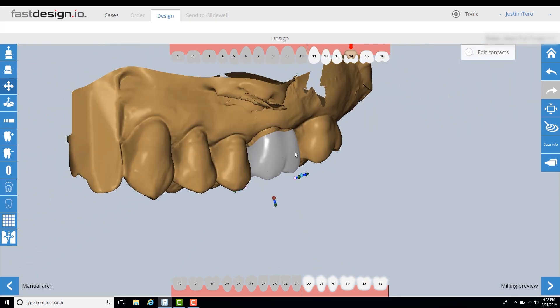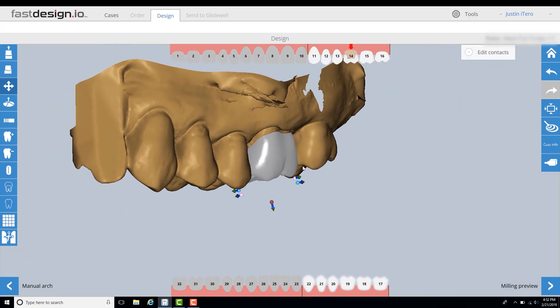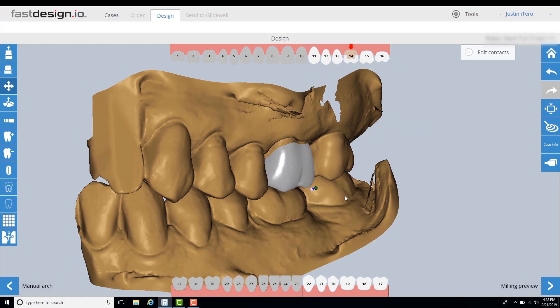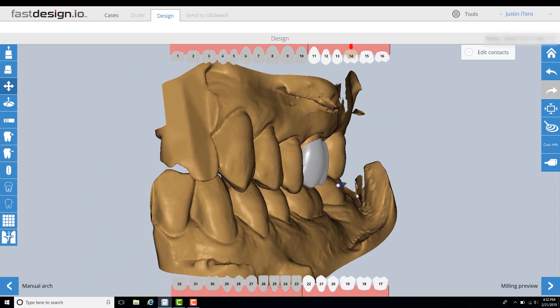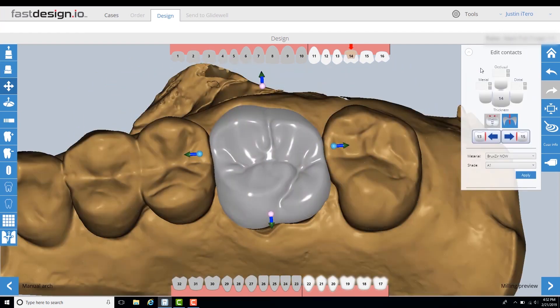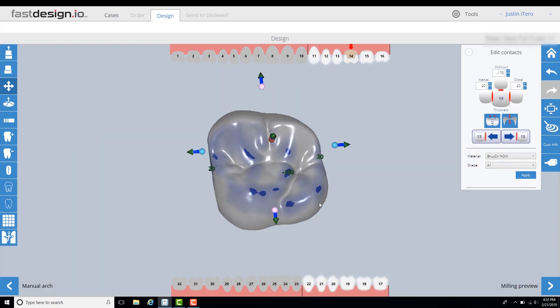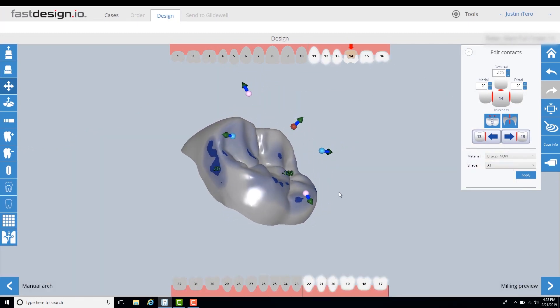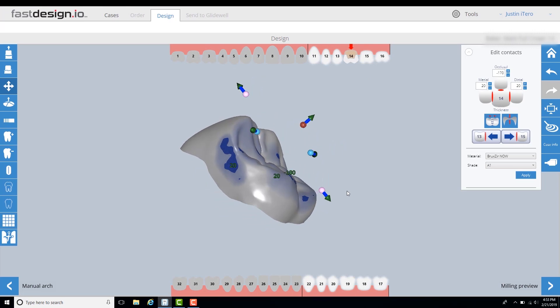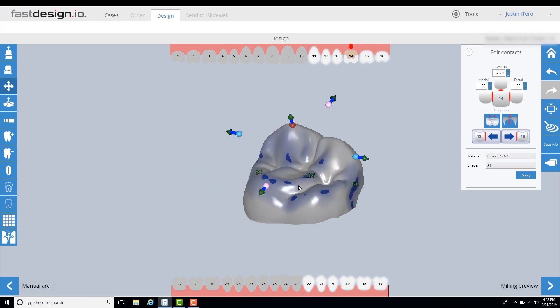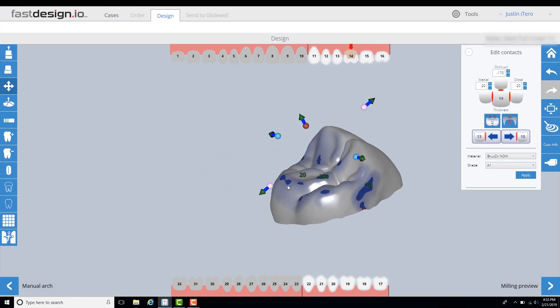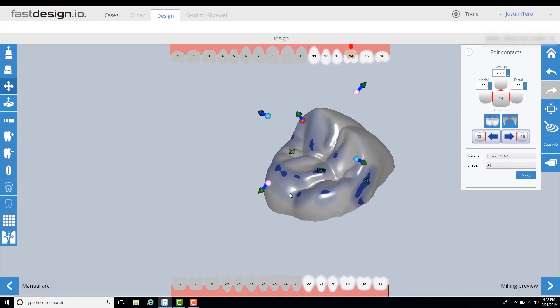Once the margins are set, the software will create a design proposal that is tailored for that restorative space. All aspects of the design — the contours, cusp shape and size, contacts, occlusion, embrasures — they can all be adjusted to meet the specific needs of the patient as seen fit by the clinician.